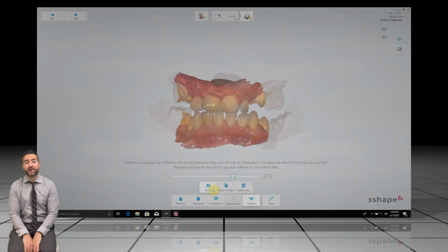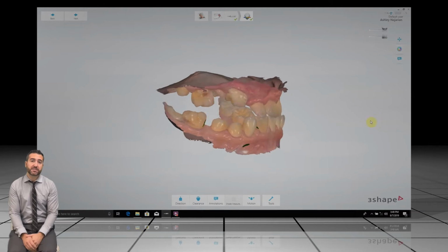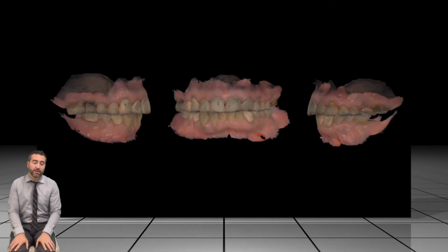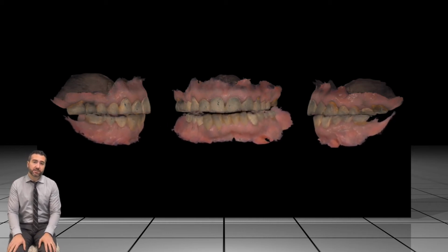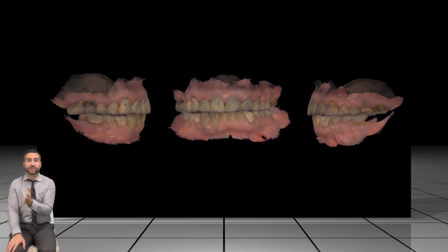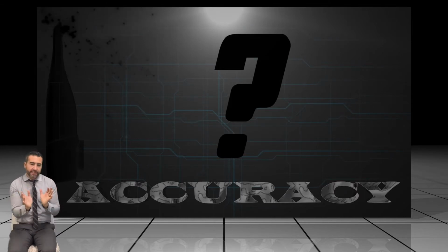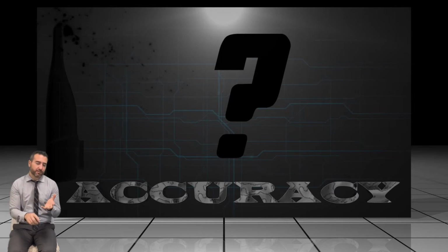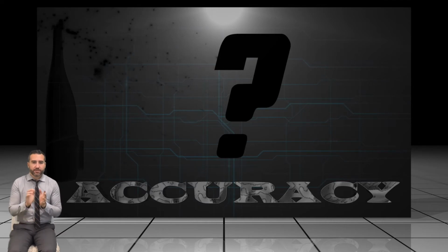3Shape's leading the way with not only just sending the color models, but also sending this 4D patient-specific jaw motion tracking to the laboratory. So with 3Shape, you could hold the scanner in the mouth and get the patient to slide into excursive lateral and protrusive movements, and you could see in real time the jaws following the patient-specific motion. That could be transferred over to a laboratory as well. So you're getting not just an impression sent, you're getting color, you're getting jaw motion tracking in some instances. You're getting a lot more information than what is in a physical impression.